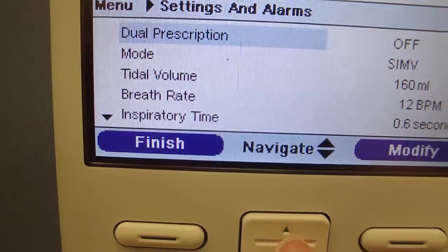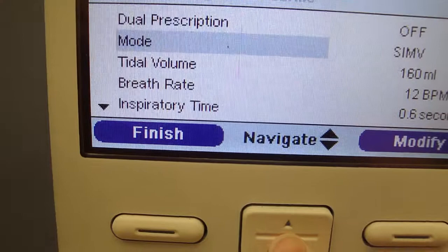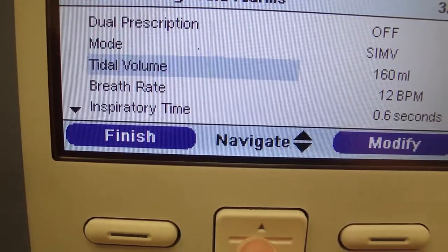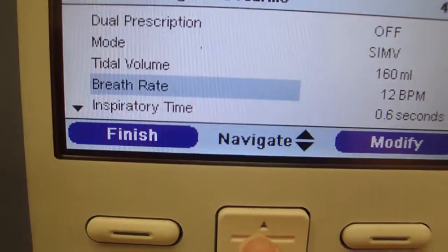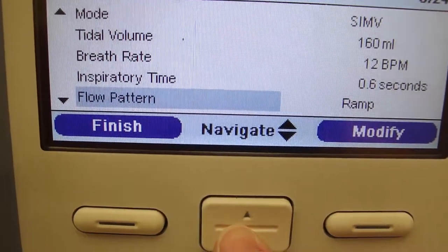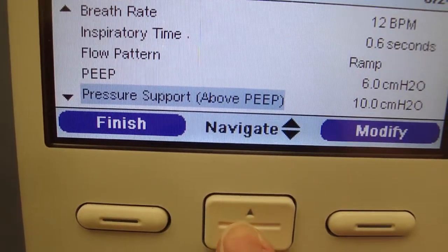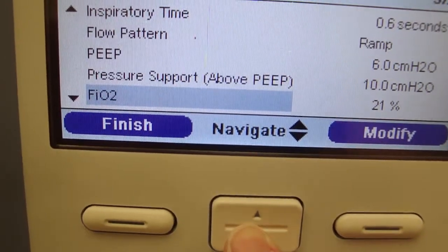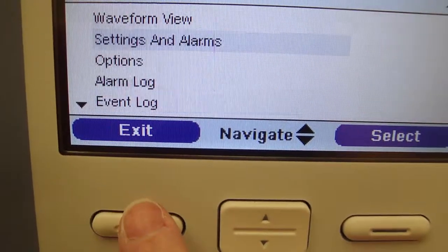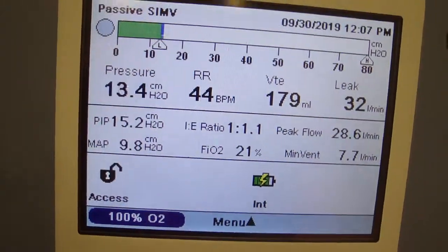You're not going to change any settings — this merely lets you review the settings. So we'd like to see what mode we're in, the tidal volume, the breath rate that is set, the inspiratory time, and then the PEEP. Pressure support if it's ordered, and then your FIO2. Once you've finished, hit Finish, then Exit, and you'll return to your main screen.